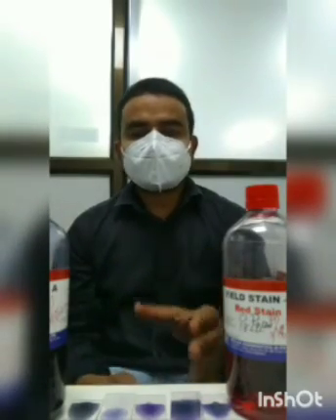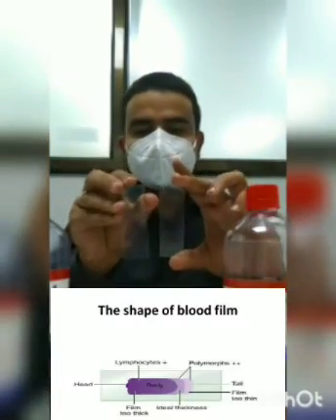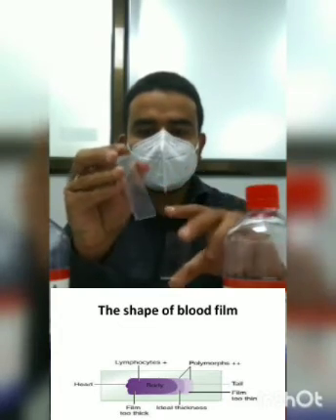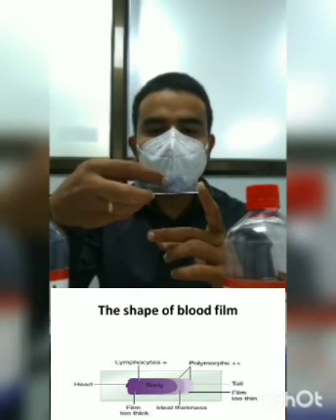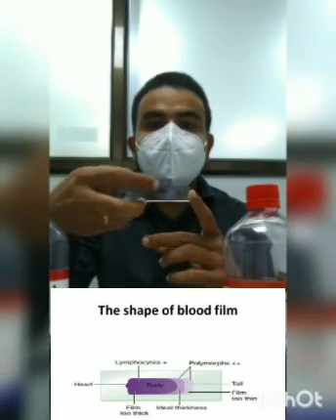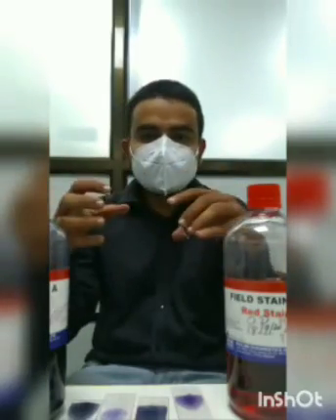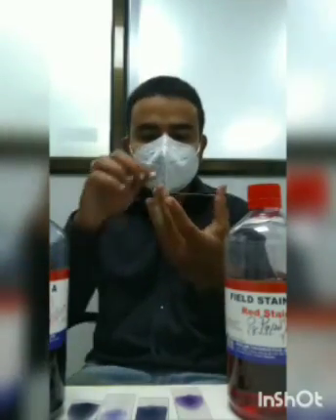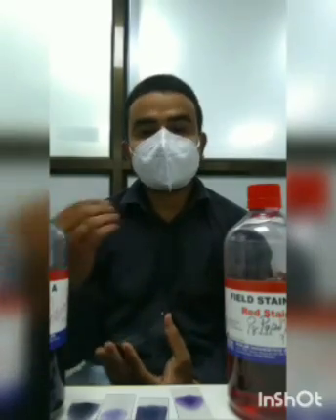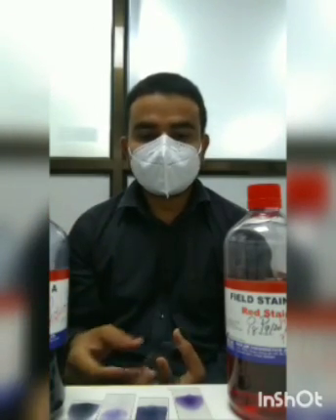After drying, these slides are examples of very nicely smeared and nicely stained slides. So this should be the ideal shape of the slide, tongue shape, and the distal 1/3 area is our viewing area. Like I said, here most of the RBCs are separated, and either they are just touching each other. Not more than 50% of RBCs are overlapping each other. So in this viewing area, we are able to comment upon the morphology of different types of cells. We are able to find out the morphology of the parasites which are there.